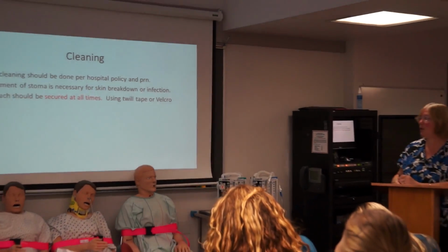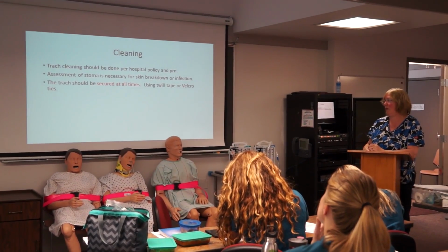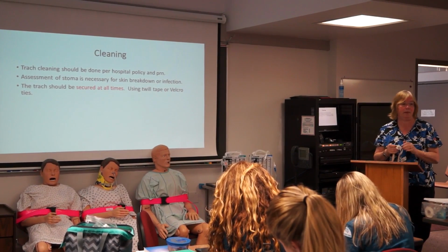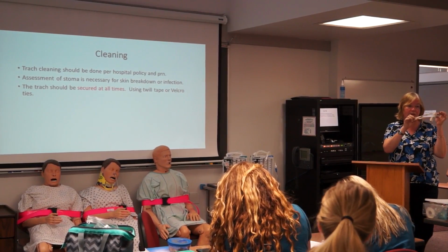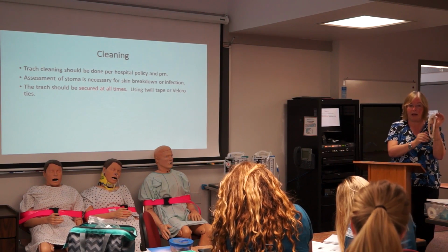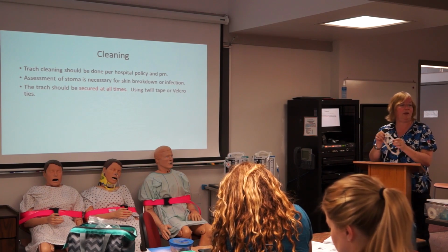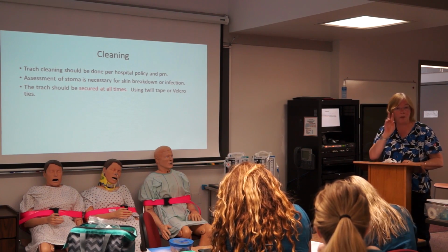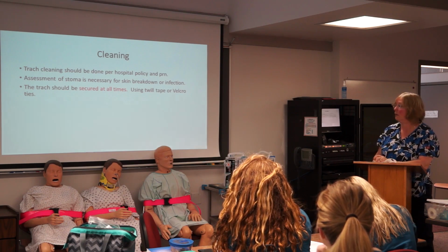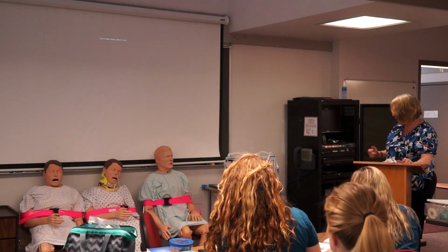Trach ties should be secured at all times, either with Velcro or with some kind of twill tape. So at all times it should be having this. Even when I'm changing trach ties, I want to have these attached. If I have to do it with being able to remove them, I want to have 2 people in there with me. Otherwise, you can do this by yourself. And that's it, guys. We're going to go to the bedside.